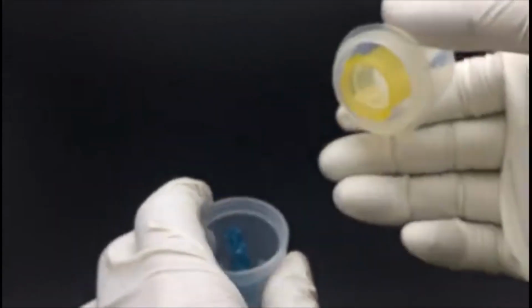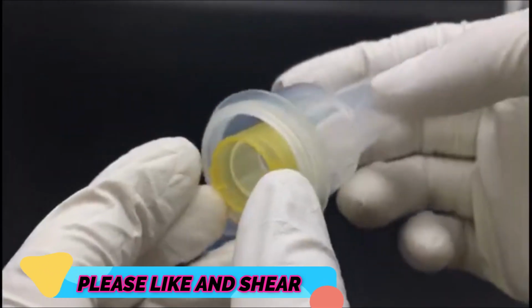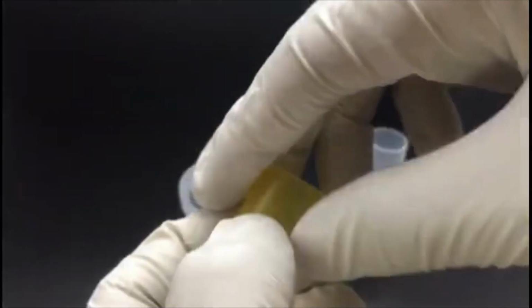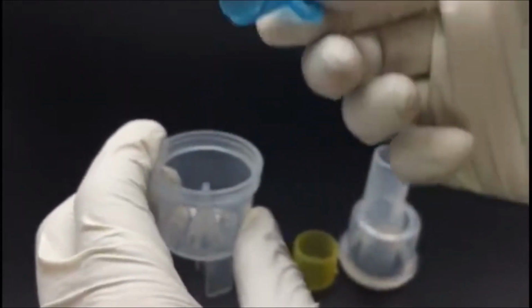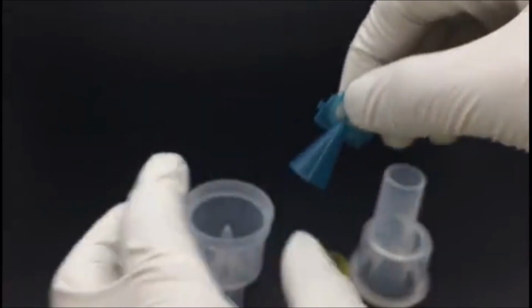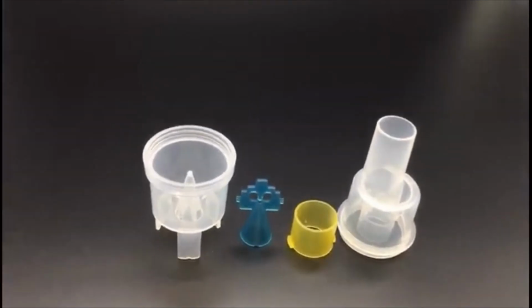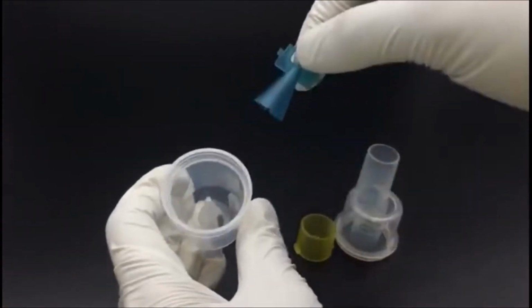Do not wash the tubing. Wipe the outside with a cloth as needed and replace the tubing if the inside looks dirty. Store the nebulizer parts in a clean plastic bag between uses. If multiple people use the nebulizer, use a separate bag for each person. Most nebulizer compressors have filters that need to be replaced every 6 months or so. You may also need to replace worn or damaged parts over time. Follow the instructions provided by the manufacturer.